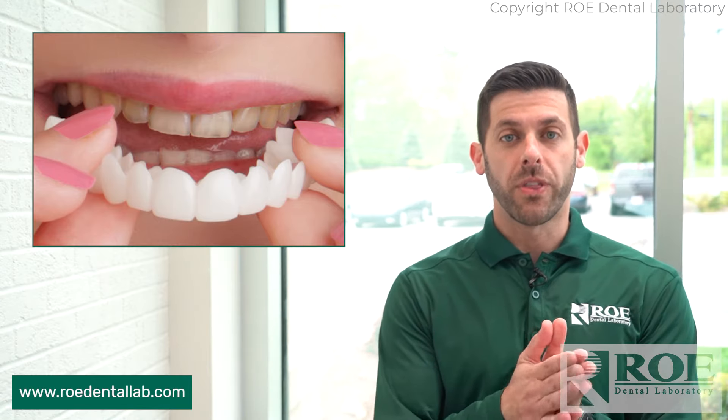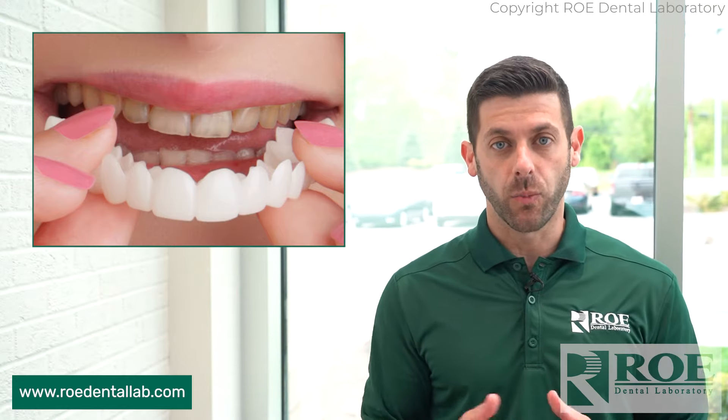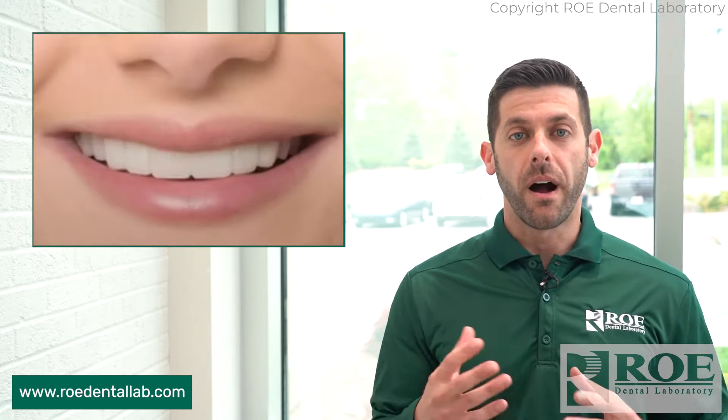One thing we recommend with our Snap-on Smiles — and we can kind of help you sell this to the patient as well — is we can do a mock-up smile for them. Just a full face, full smile photo, and we can do a very nice digital mock-up of what they can look like with their new Snap-on Smile.